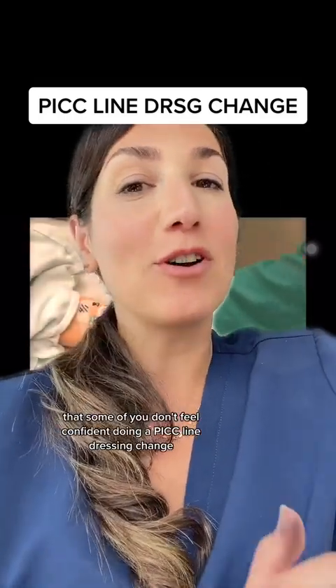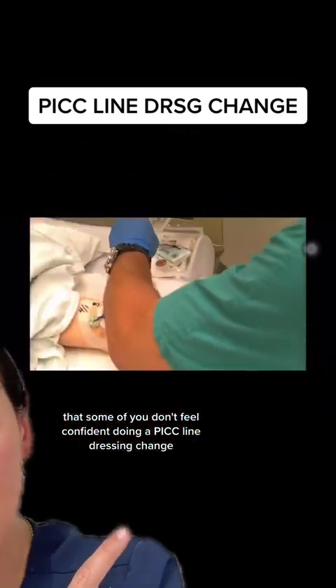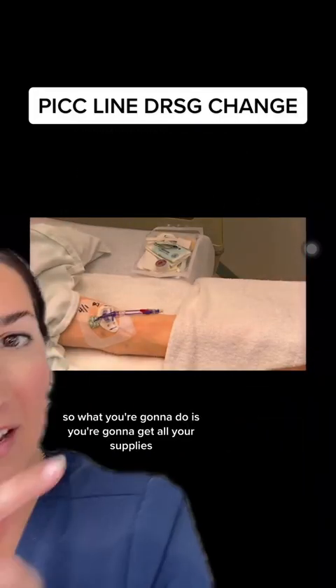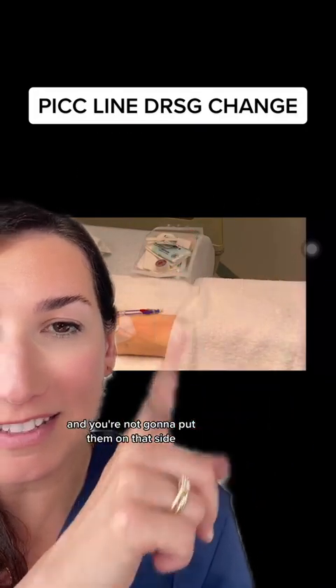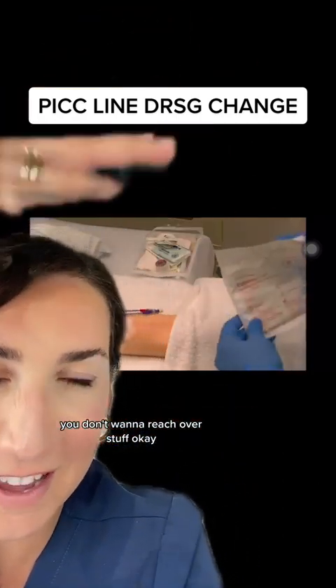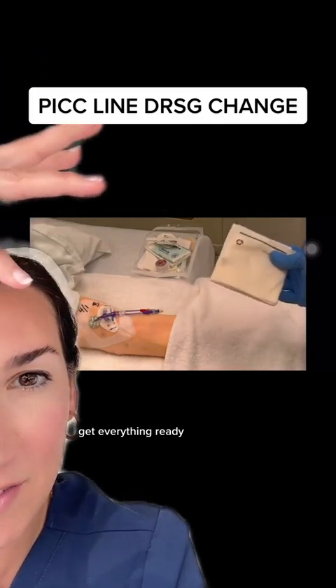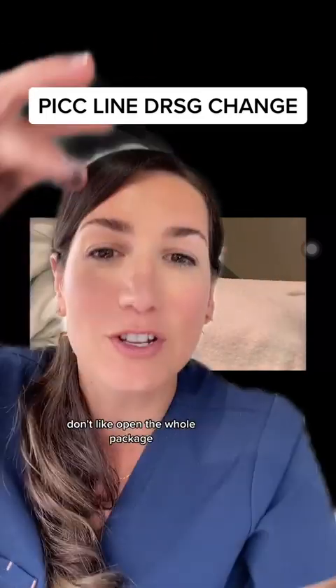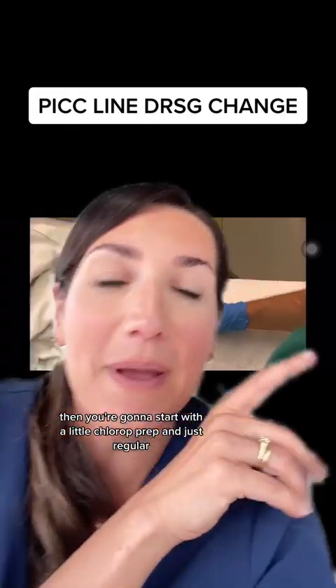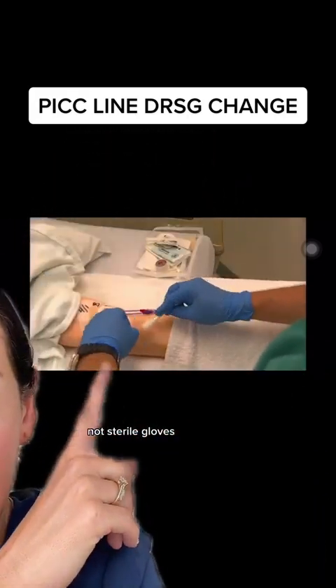It has come to my attention that some of you don't feel confident doing a PICC line dressing change, so let's go through one together. Get all your supplies and put them on this side, close to you — you don't want to reach over stuff. Open all your supplies and get everything ready, including the sterile gloves. Get them ready but don't fully open the package. Then grab your chloraprep and start with regular, non-sterile gloves.